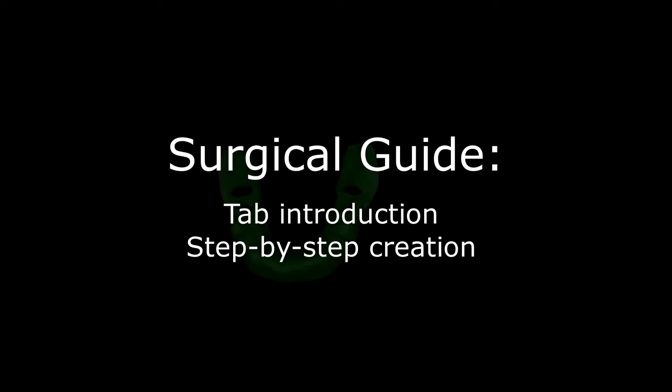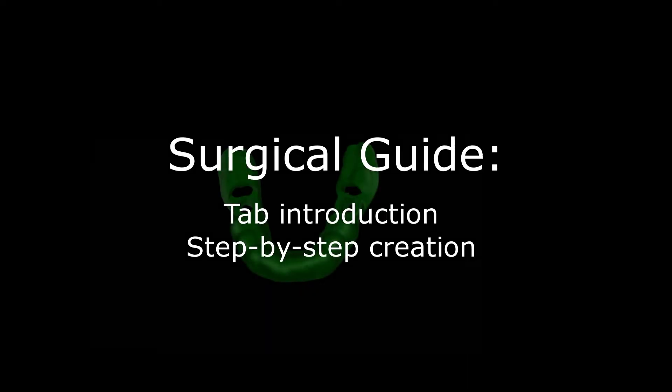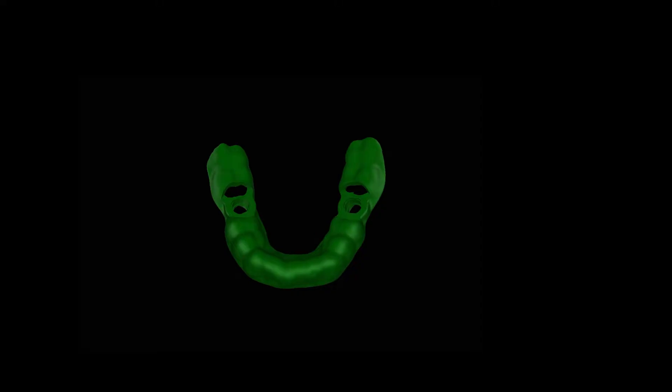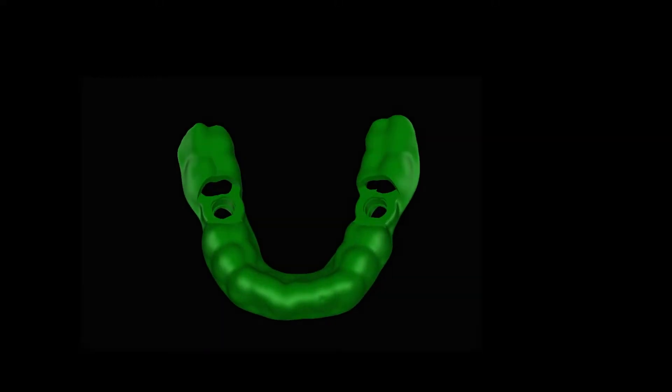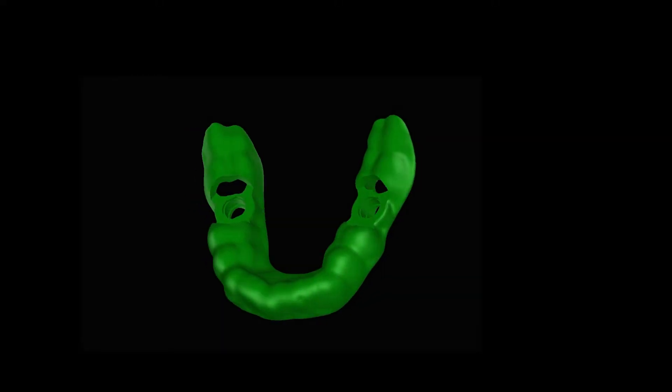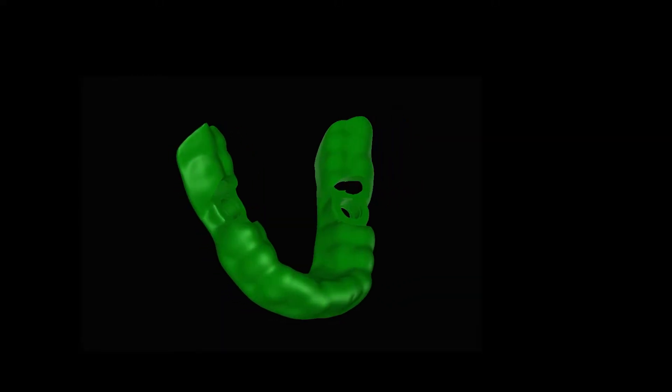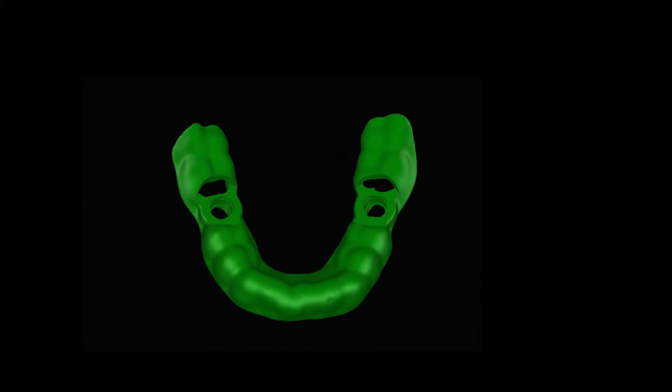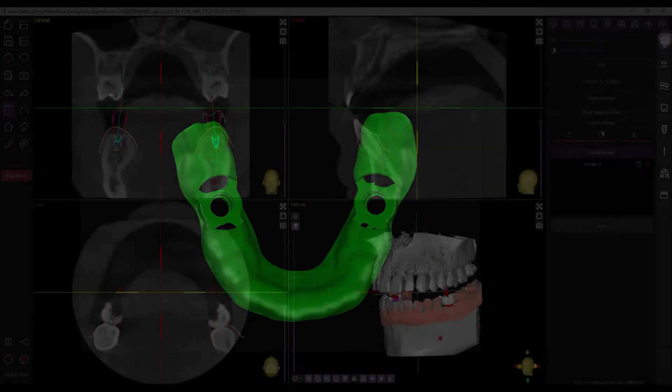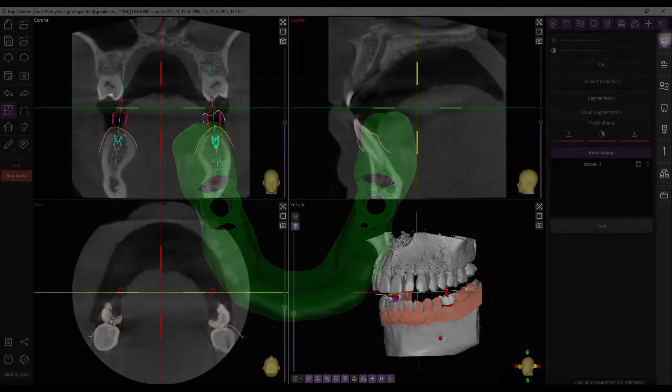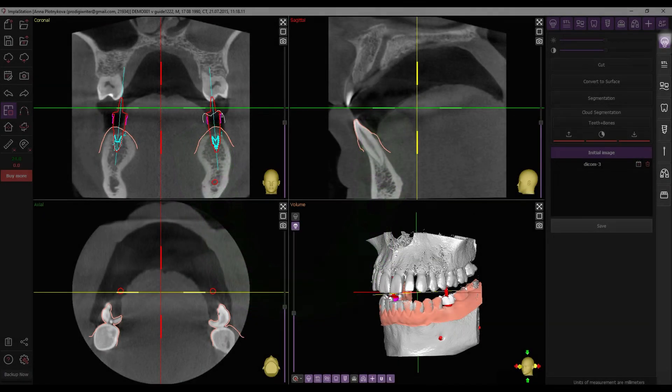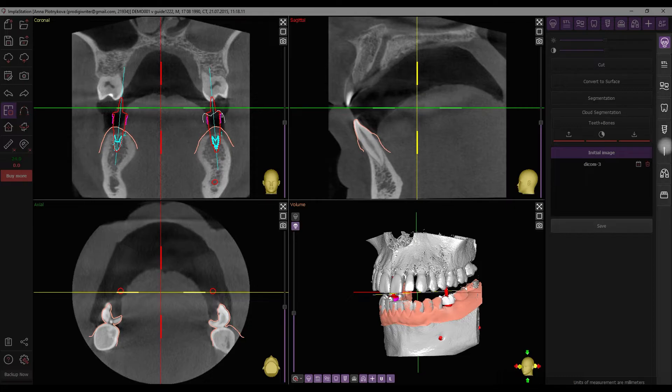Welcome to our video focused on the Surgical Guide tab of Implastation, where we'll walk you through the process of creating a surgical guide. To access the guide tab, click the corresponding button on the toolbar.